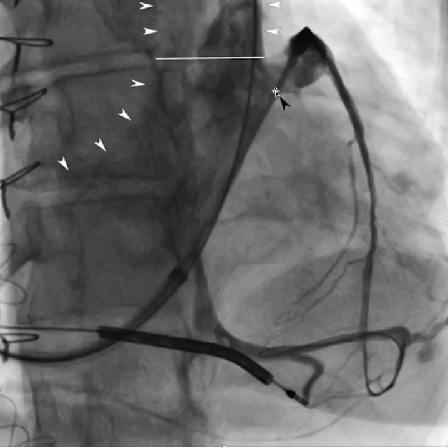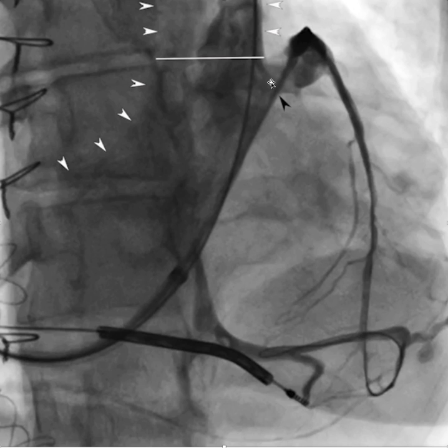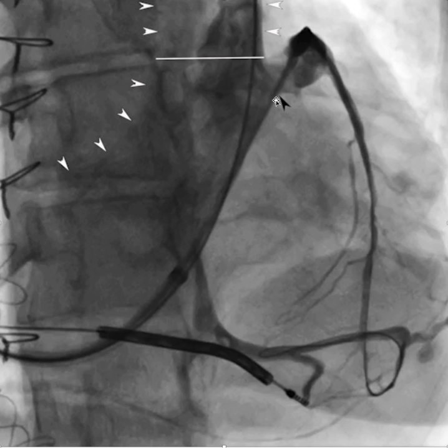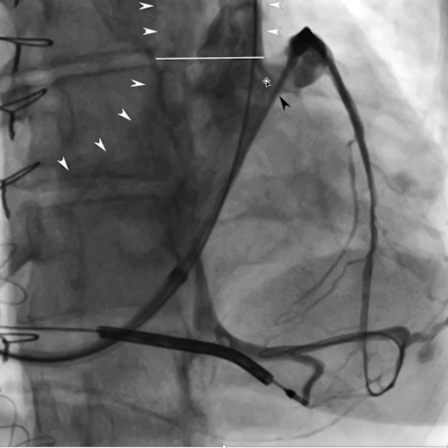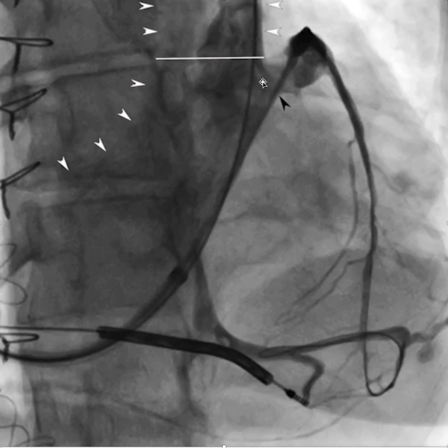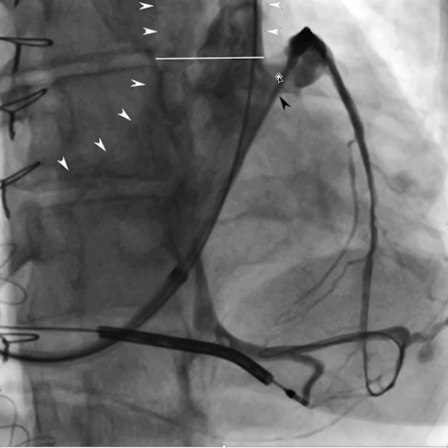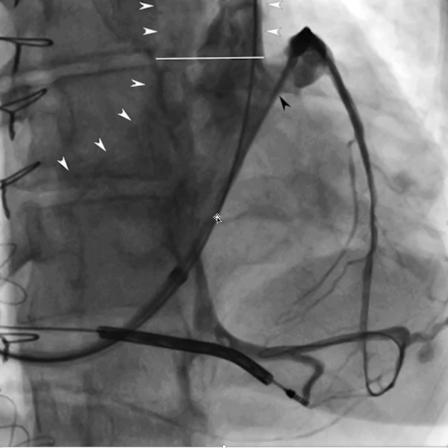Everything above the entry point is normal size. Technically, from the entry point down is defined as the coronary sinus, and from the entry point up is defined as the great cardiac vein.